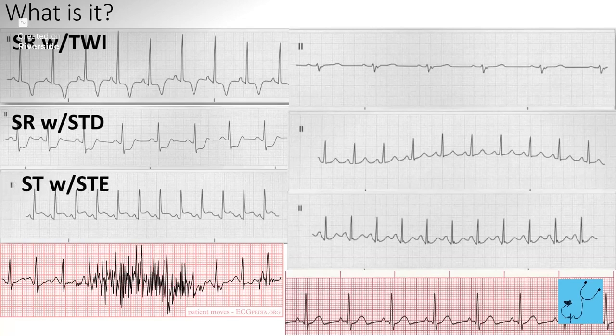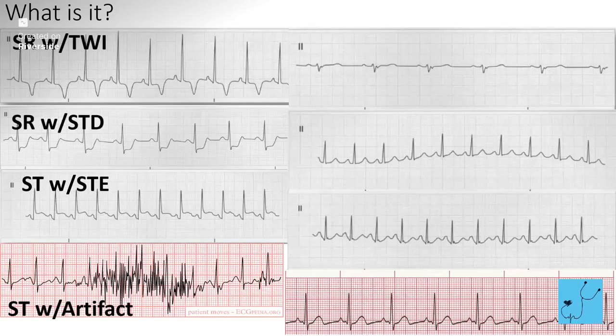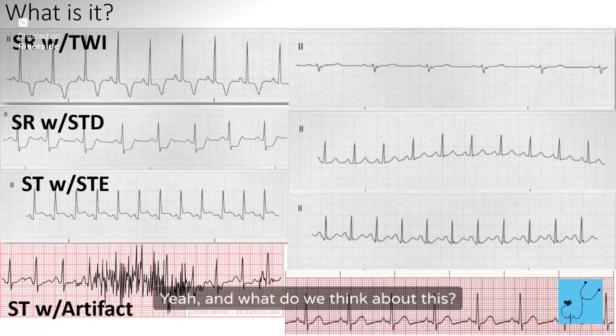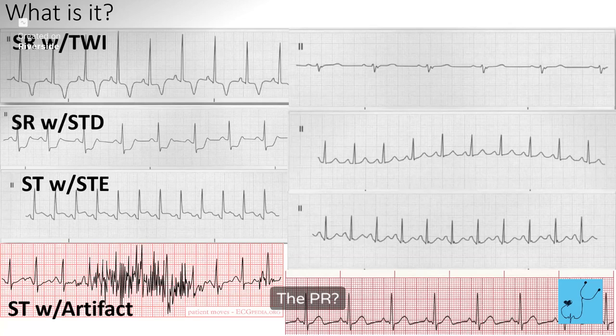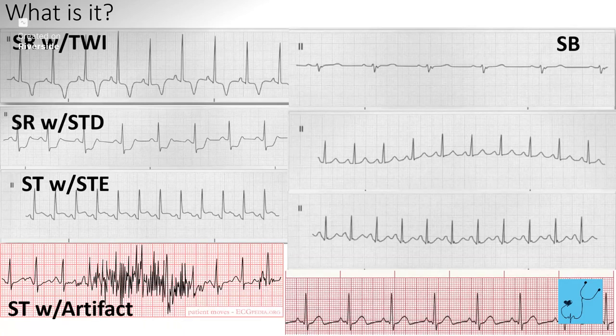And this, artifact. How about up here? Yeah, and what do we think about this? The PR? Yeah, it's kind of long, right? It looks long. So I would add a first degree block, and then I'd have to measure, but yeah, it looks like the QRS is also a little bit long.